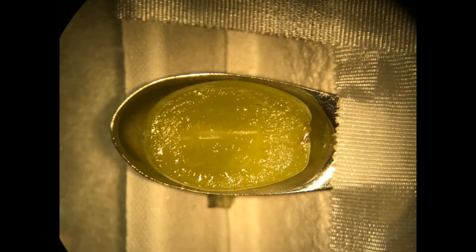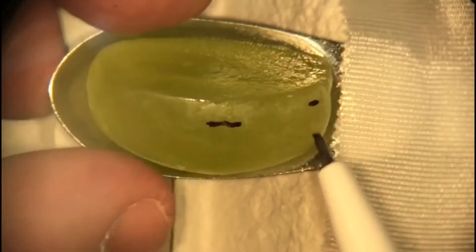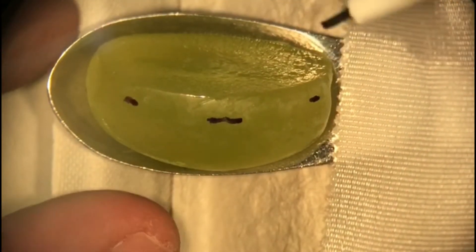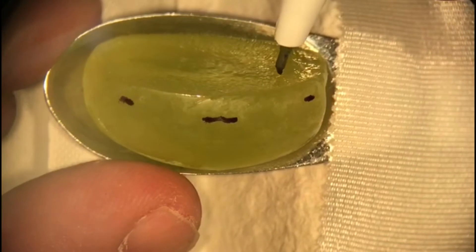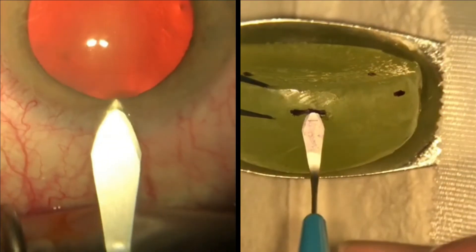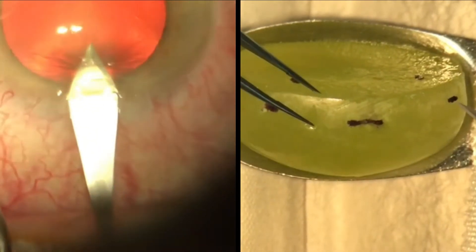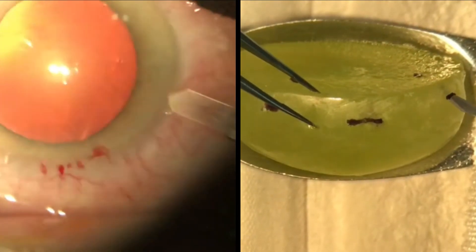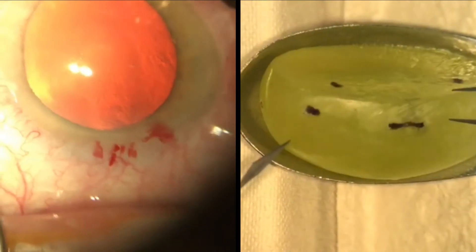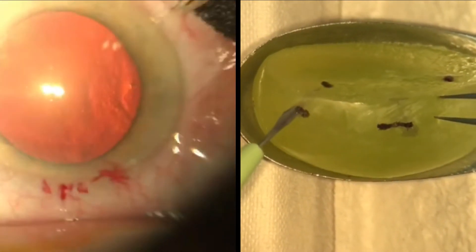The first step in cataract surgery involves making corneal incisions. We have used a grape with markings on its surface to simulate this. Ideally, we would use the notched forceps to fixate the globe at 180 degrees opposite to the incision; however, this was not possible with the grape. Place the tip of the keratome against the surface mark on the grape and tunnel into the incision. Similarly, for the side port incisions, use a slit blade to make the incision and enter the globe at a predetermined point. This exercise allows for practice of accurate placement of instruments as well as trajectory into the globe.